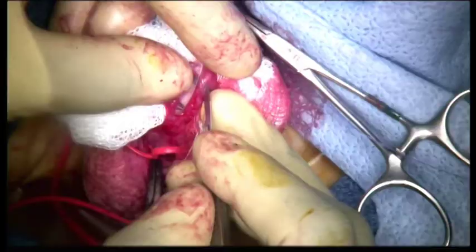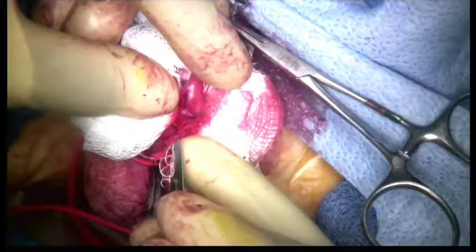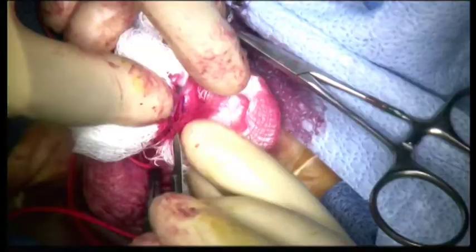Using the technique described by Snodgrass, the dorsal urethral plate is split in the center to permit the plate to be tubularized around the stent. Incisions on either side of the urethral plate are extended to permit the plate edges to be approximated around the stent. Dissecting the glans partially off the corpora allows the glans to be wrapped around the neourethra.